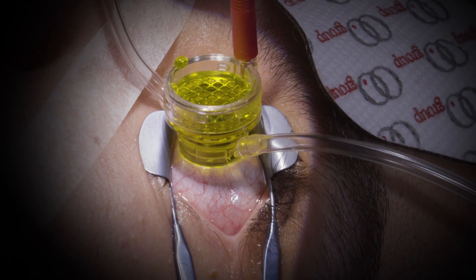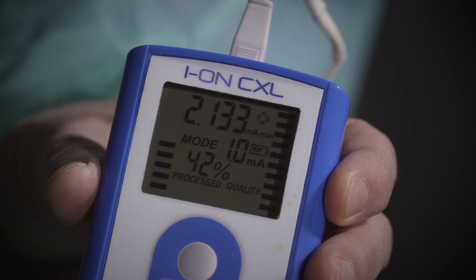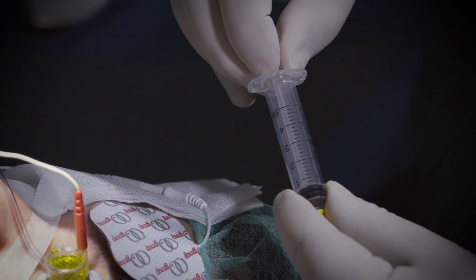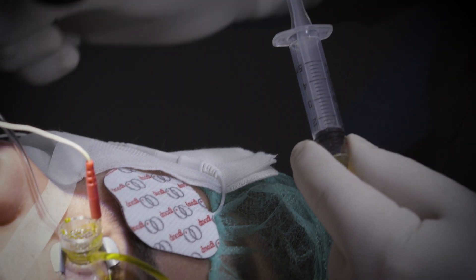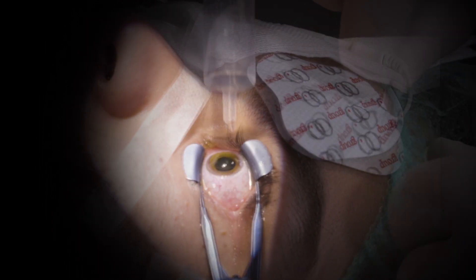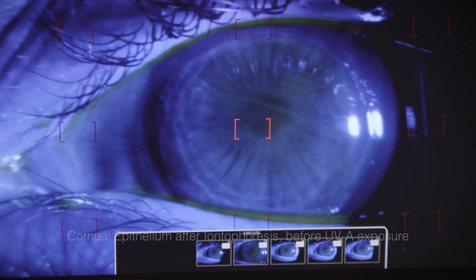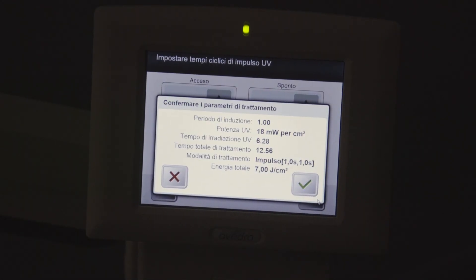We have started the ION CXL — five minutes. It's perfect. And now we can stop the suction ring. The iontophoresis is over; now we can aspirate the solution and stop the suction ring. Perfect.